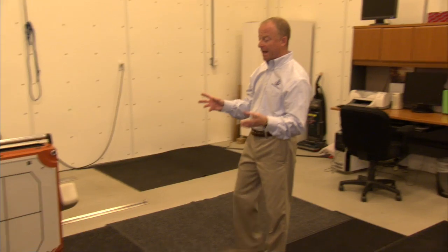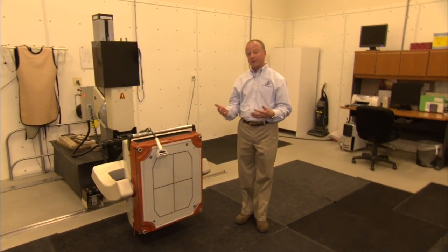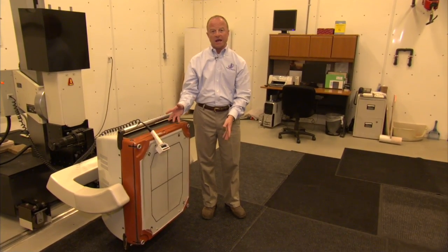Okay, so this is nuclear scintigraphy. This is another really cool diagnostic tool that we have to try and figure out what's wrong with the horses. We put a catheter into their vein and we inject a radioisotope into their vein, which spreads through their whole body, and it goes in particular to the bones. Then, after about 3 hours, we bring them in and we stand them right in front of this camera. This is basically a giant Geiger counter.